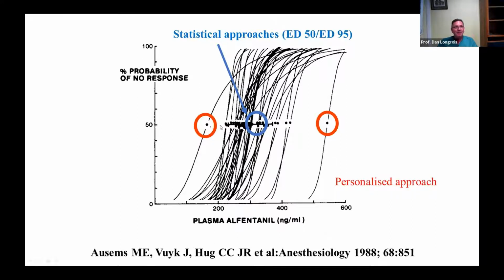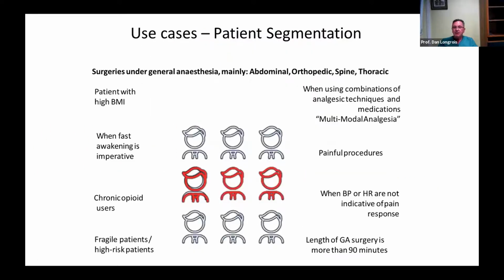And this is exactly, in my mind, the most important part of such monitoring: personalizing, individualizing dosing, because the differences between patients are so high that without monitors you cannot reliably detect such interpatient variability. So this is in my mind a very important issue.